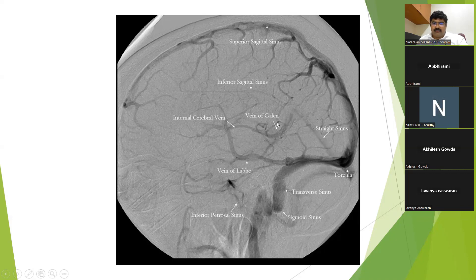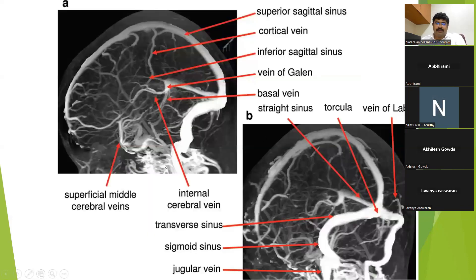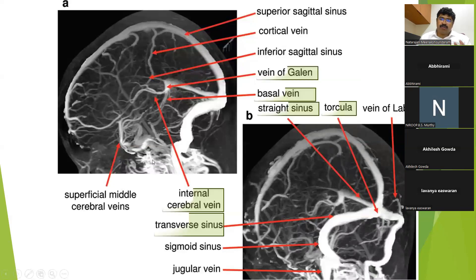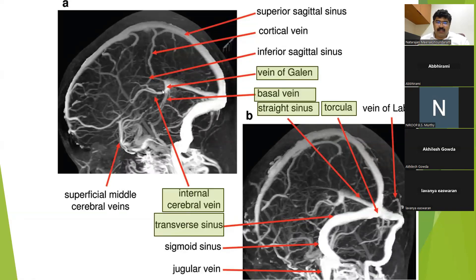This is the vein of Galen. The vein of Galen is formed by the union of the two internal cerebral veins and the basal vein of Rosenthal. The vein of Galen then drains into the straight sinus. These are the important venous tributaries which you should remember.